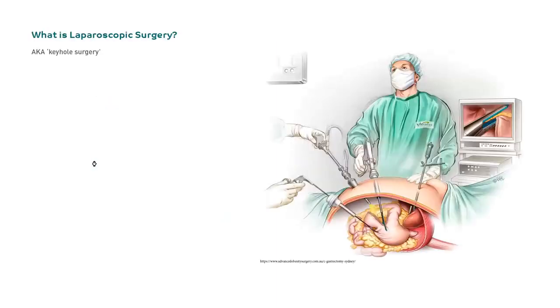So what is laparoscopic surgery? It's keyhole surgery or minimally invasive surgery. You can see in this little illustration here that it involves pumping the peritoneal cavity up with CO2 gas, not oxygen, because oxygen is flammable, and that's not good. So you have these ports, and there's 3 to 4 ports, and the surgeon works with these really long instruments, and all they can see is whatever's on the camera. So this tiny little window here.